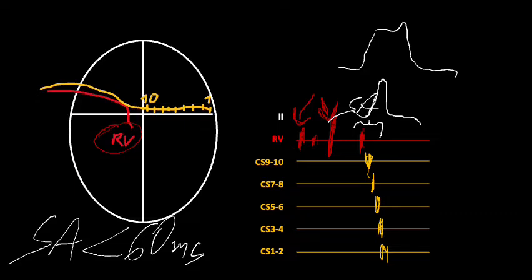I encourage you to perform this maneuver because practice is very, very important, and with this maneuver you can easily differentiate the patient with and without the accessory pathway close to the bundle of His.